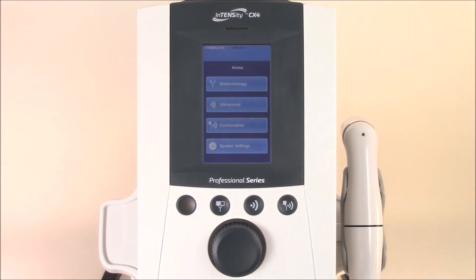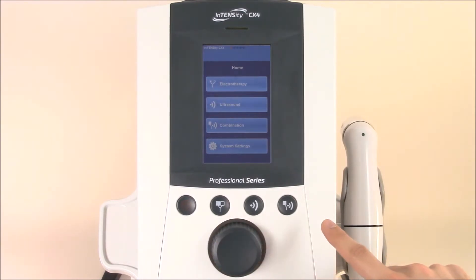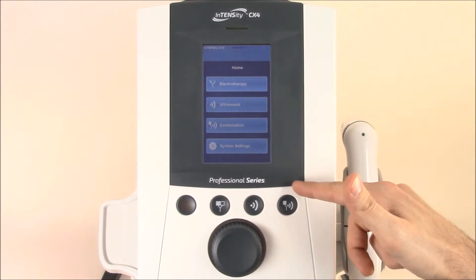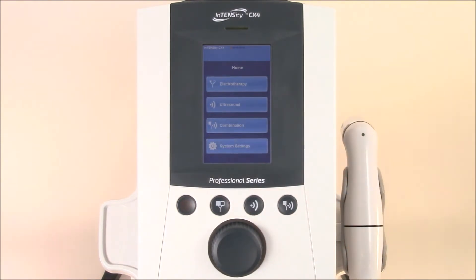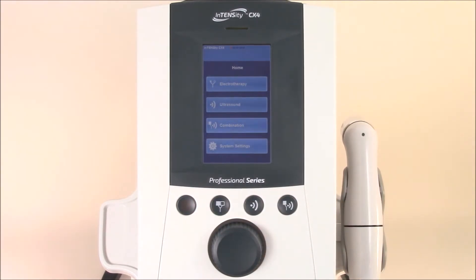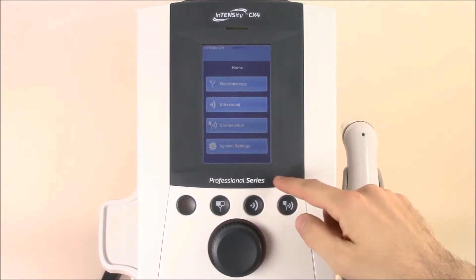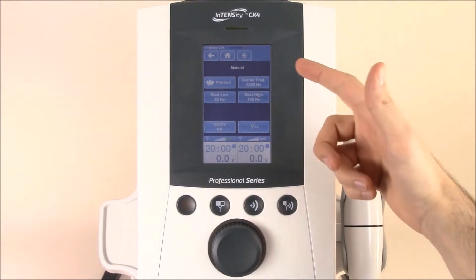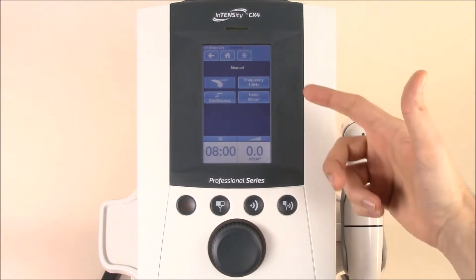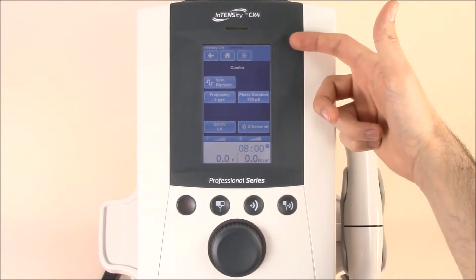Before we jump in and use the intuitive touch screen, let's look at the user quick access buttons below. Here you'll find the electrotherapy button, ultrasound button, and then the electrotherapy and ultrasound combo button. You'll also find the stop button here. You can quickly access each of these by selecting the button, which jumps you right into the electrotherapy screen, the ultrasound screen, and finally the combination screen.